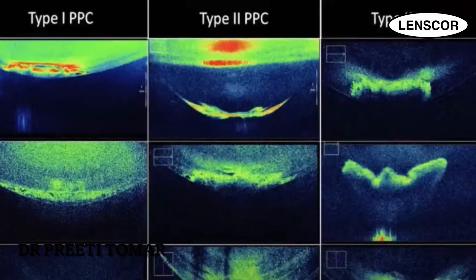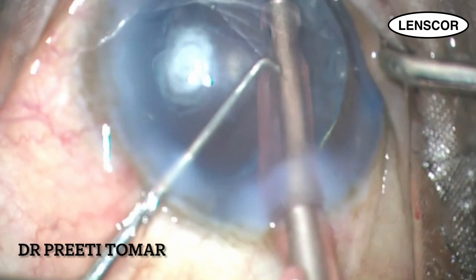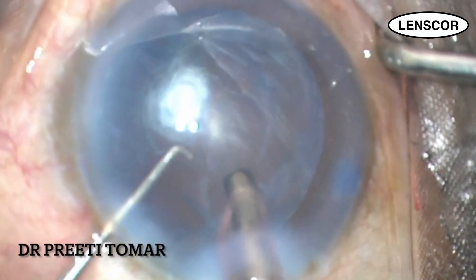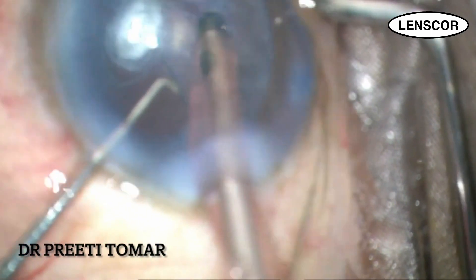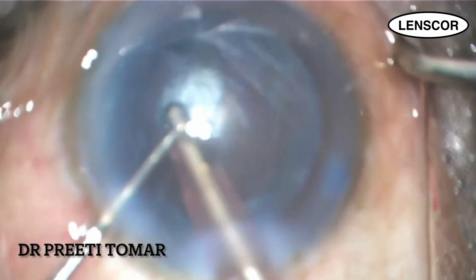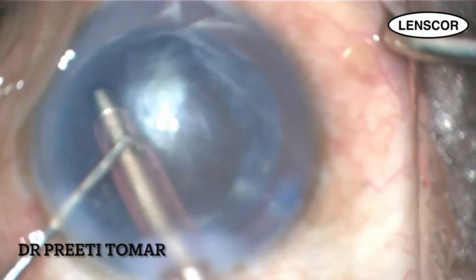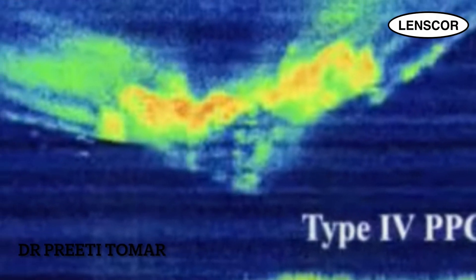There are four types of PPC based on intraoperative OCT. Type 1 PPC shows a clear delineated posterior capsule with a hypoechoic clear space between the opacity and the capsule. In type 2, there is inability to delineate the posterior capsule in the center, meaning dense central opacity adherent to the posterior capsule. In type 3, there is inability to delineate the posterior capsule along the entirety of the opacity — type 3 has the most common tendency to have a posterior capsular tear. PPC type 4 is an open capsule.